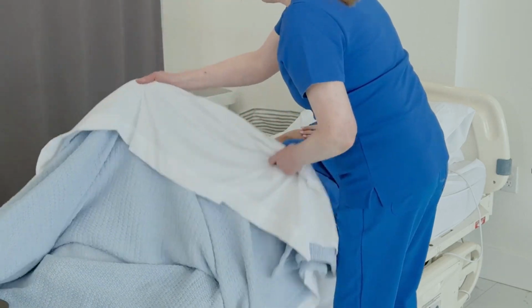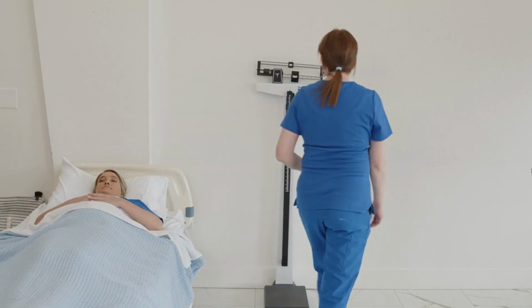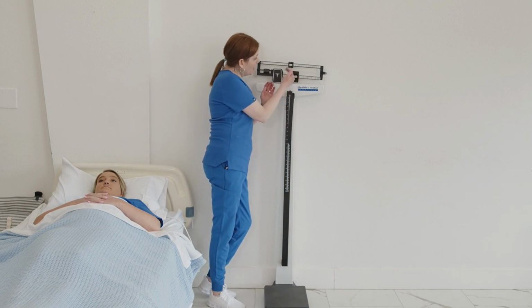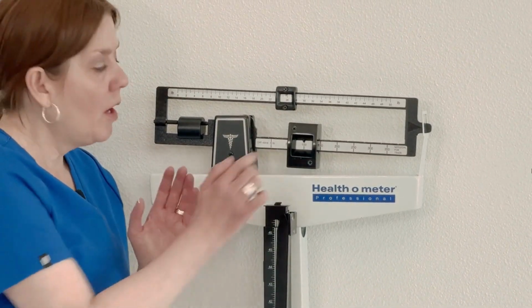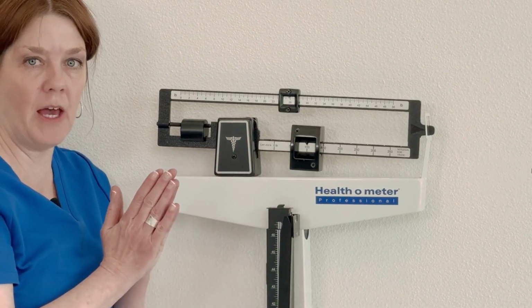I want to come back to my scale for my number. So I'm going to add my weight at the bottom to my weight at the top. So I have 100 at the bottom. I've got 26 at the top. I'm going to combine those together for a total of 126 lbs.